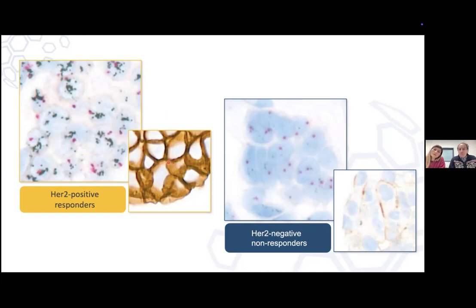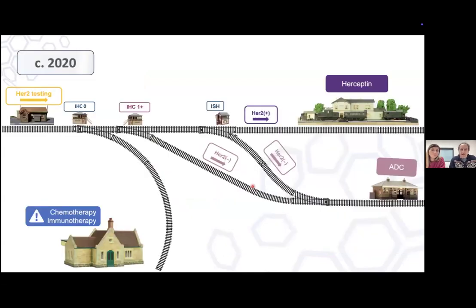And because in most cases, I'm talking about 95+%, the amplification was expressed, the difference in protein level was very telling. Okay, but a few years ago, the situation started to be complicated. And you can see here, we got another station.